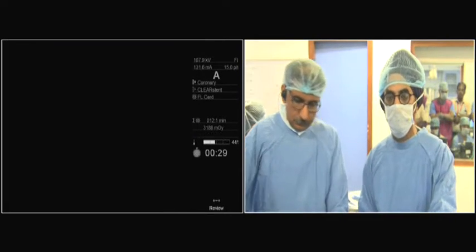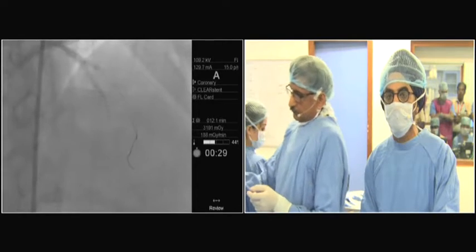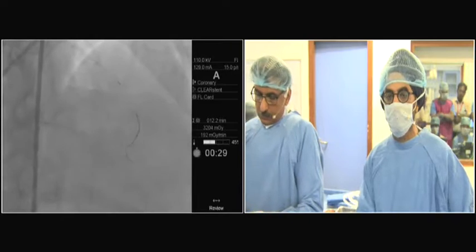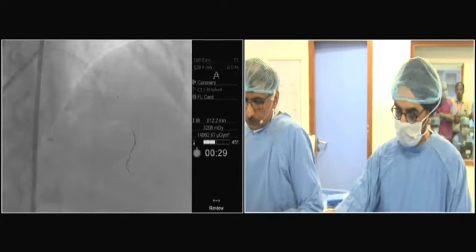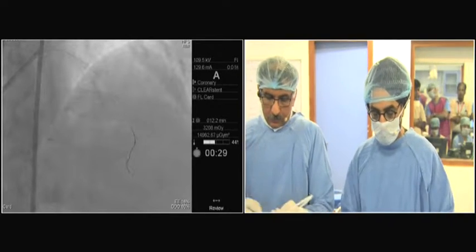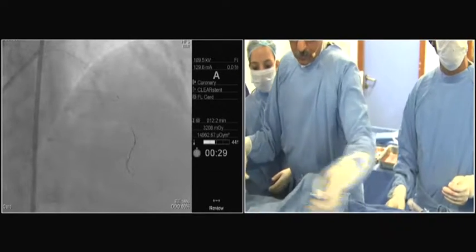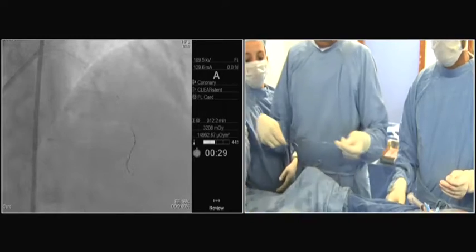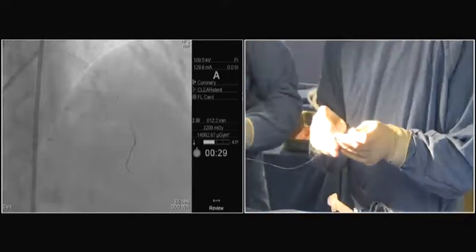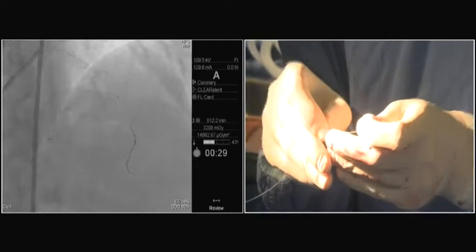Beautiful pictures have been shown in the past by Yoshi Murasato here. I remember the case. But here we see clearly that you are inside the stent. So the caution you have is to try to cross proximally, but not distally, not close to the carina. So I'm going to do the kissing now. Then I will take an IVUS and then decide about the post dilatations.